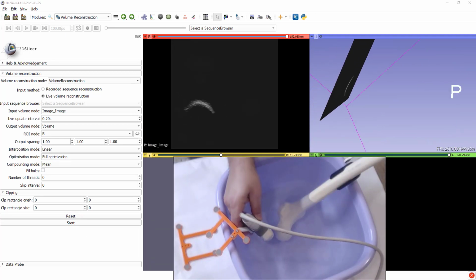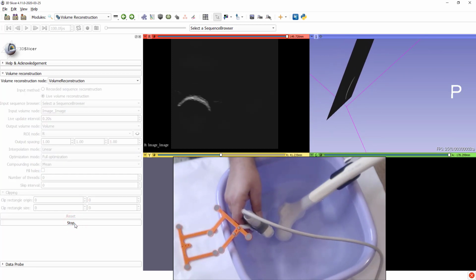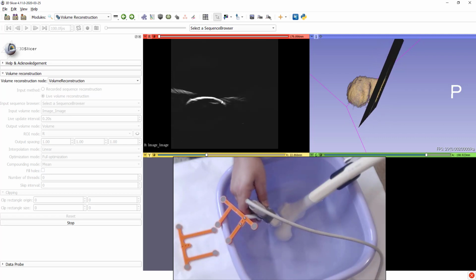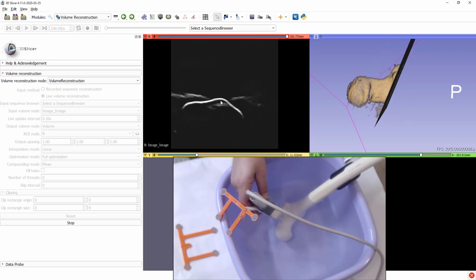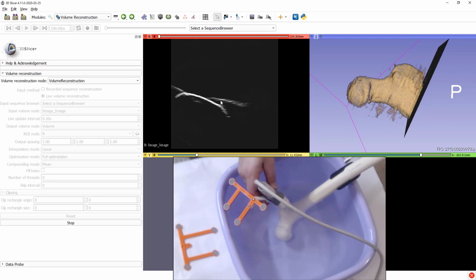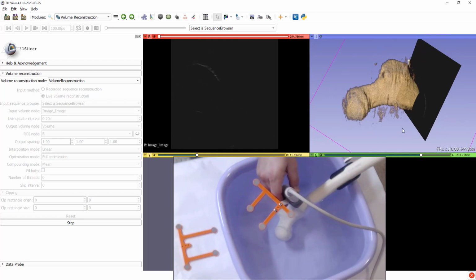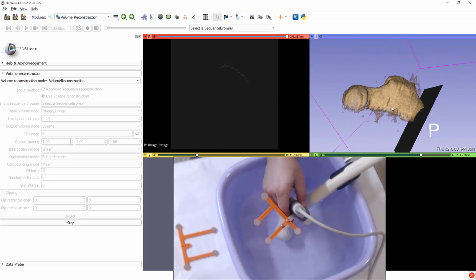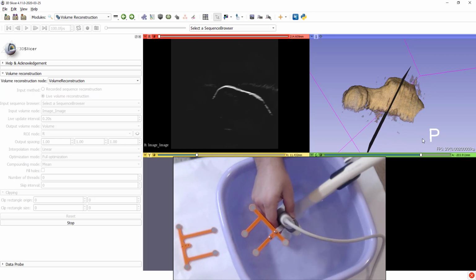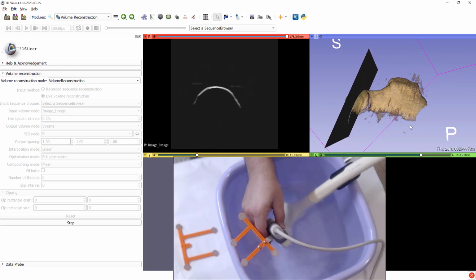The next example shows the mean compounding mode. So in this way, when multiple input ultrasound images are available for the same voxel location in the output volume, the values from the input images are averaged. This creates less noise in the output volume because random noise will cancel itself by averaging. On the other hand, the bone surface will not look as solid because some parts will be averaged with acoustic shadows.